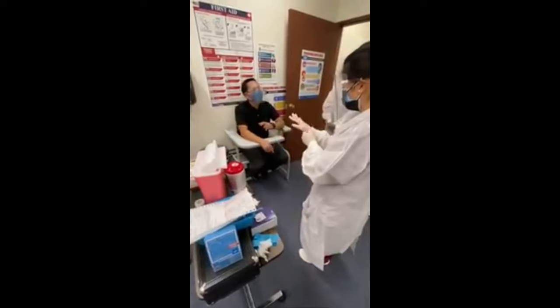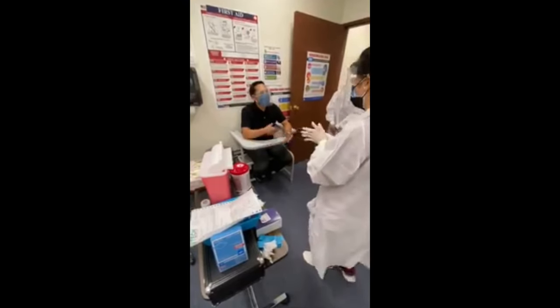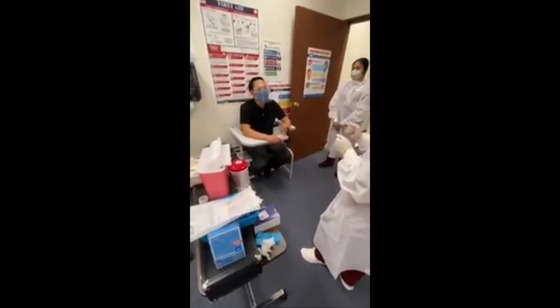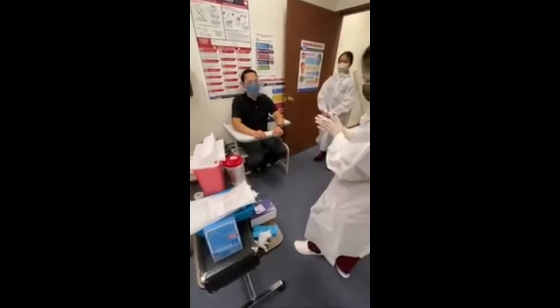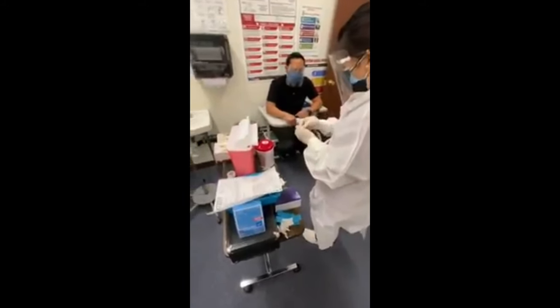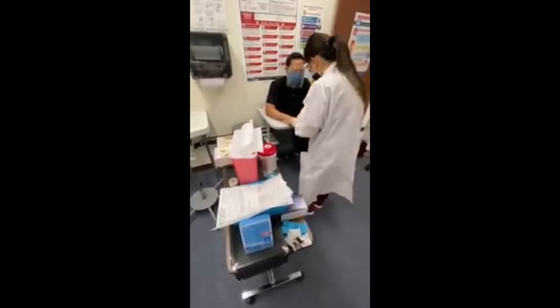This part here where you feel for it is just because you guys are starting out. But if you're used to it, then you could skip that whole process of feeling without the glove. If you feel comfortable feeling with the glove, then you could do it straight. Oh, sorry. Okay. Let me just sanitize.